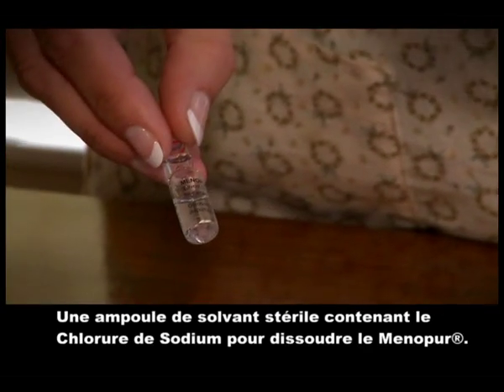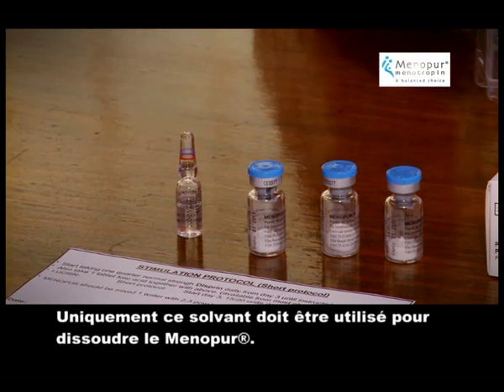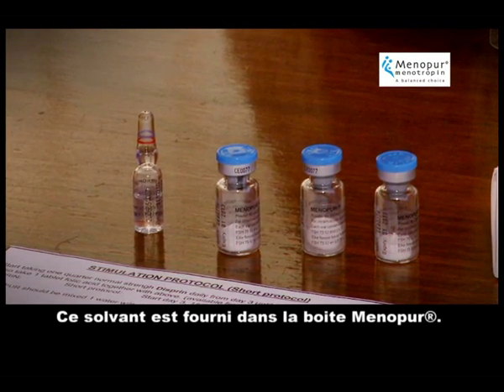One ampule of sterile solvent containing sodium chloride for dissolving the Menopur. Only this solvent should be used to dissolve the Menopur. The solvent comes packaged with Menopur for your convenience.